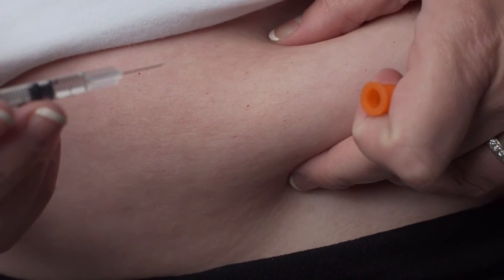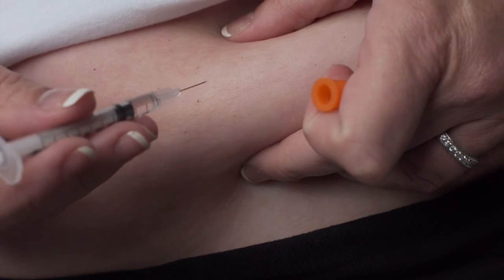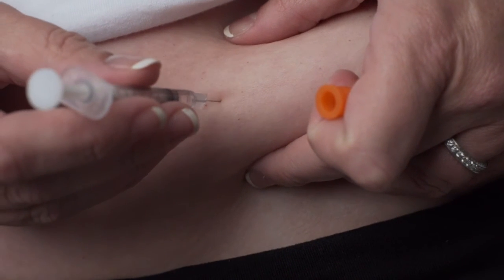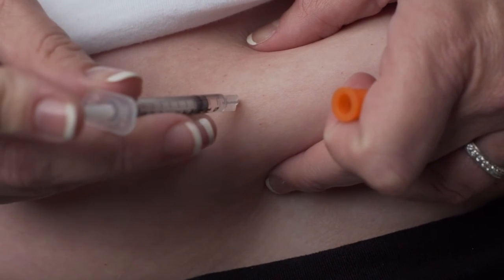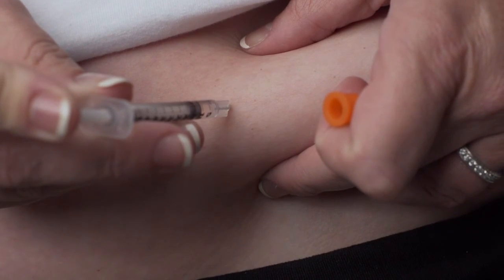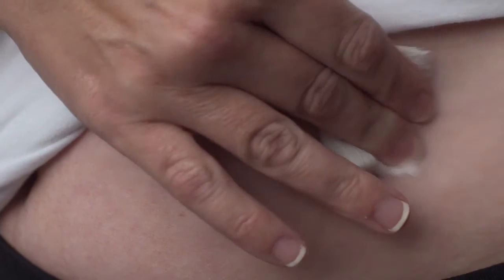Insert the entire length of the needle into the fold of skin at a 45 to 90 degree angle. Once the needle is inserted, release the pinched skin and push the plunger in a slow, steady motion until all the medication is injected. Gently withdraw the needle and apply pressure to the injection site with a sterile gauze pad.